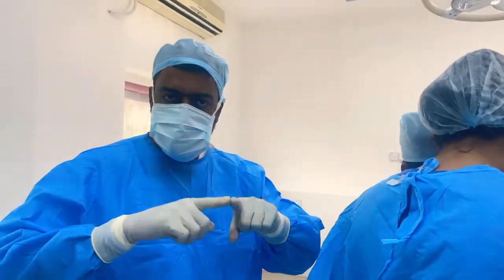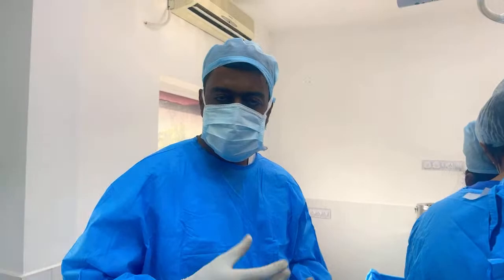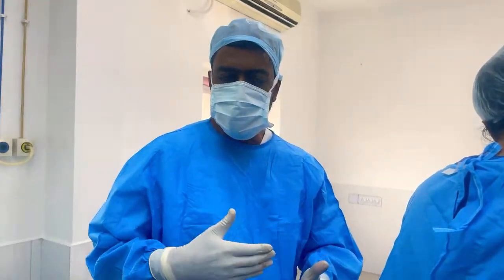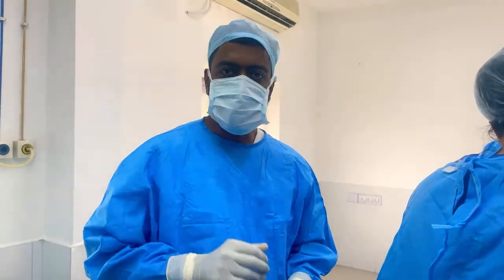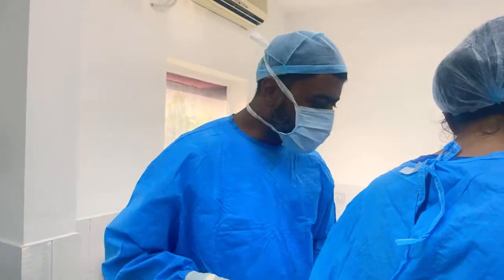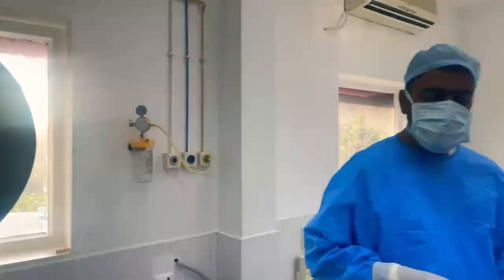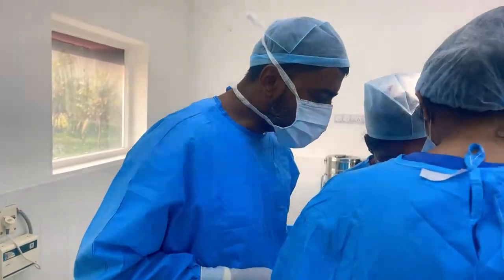All the surgery is done from inside the mouth, and we've removed some pieces of bone. We've augmented some parts, so a combination of osteotomies, osteoplasty and osteectomies, all three components done in this surgery. I hope this was useful. If you have any doubts, then you can shoot in your questions and we'll be happy to answer them for you.